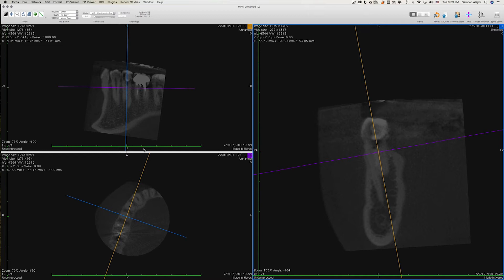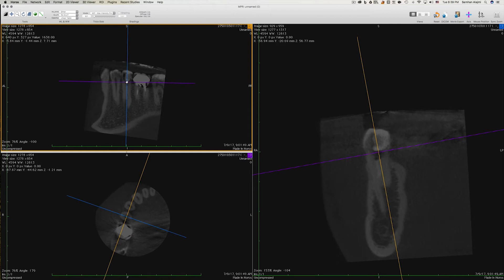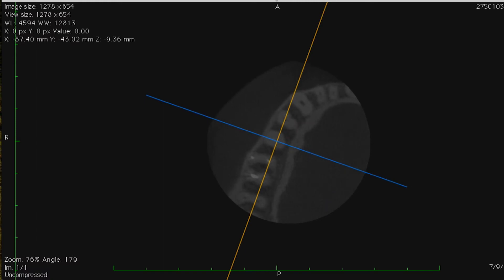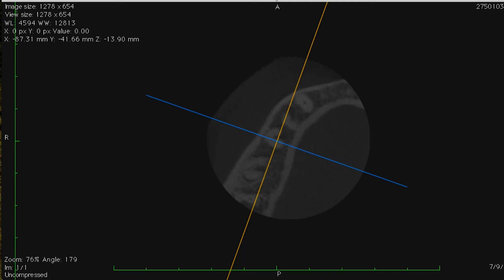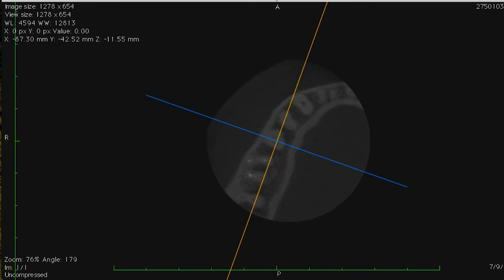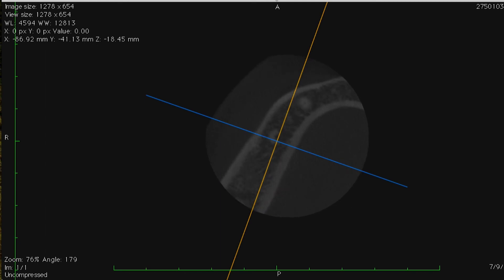Anyway, let's focus on our premolar. I'll move the viewer in the sagittal view and go from the crown down to the apex. I'd like you to focus on the axial view - it starts as one canal, and as you go apically the anatomy is going to completely change and becomes from one canal to a C-shaped canal.